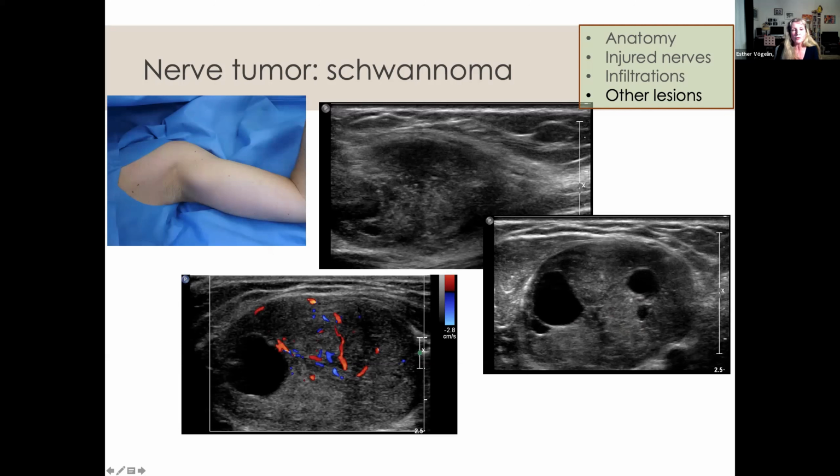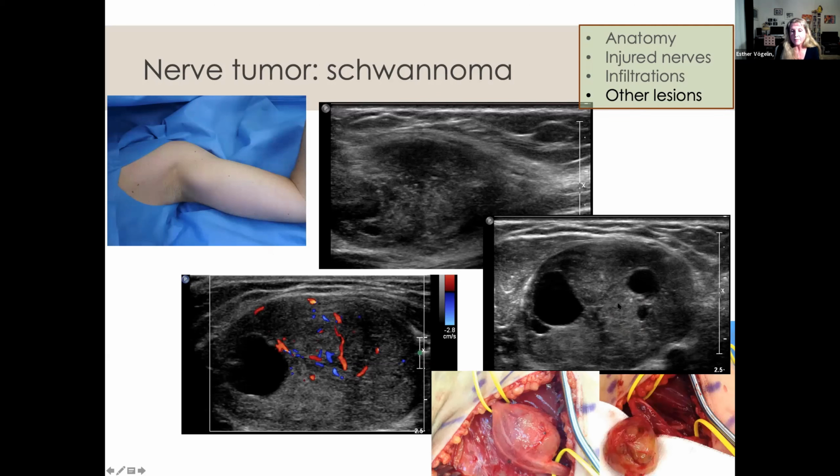You have seen earlier also the Doppler mode or the color mode, and you can check the vascularity of a tumor. You see here there are cysts. There are also calcifications around this, and this is the typical feature of ancient schwannoma. The more experience you get, you also can see the fascicles along the tumors when you follow the fascicles with the sonography proximal and distal.